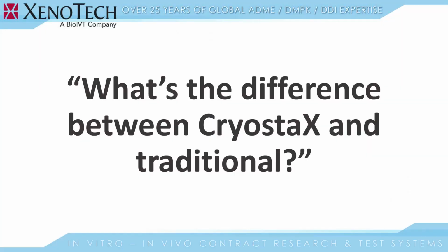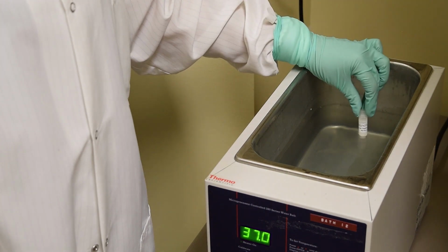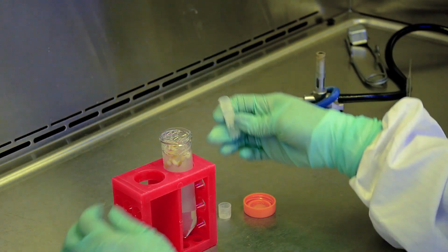The only difference between CryostaX vials and traditional vials is the method by which they are cryopreserved. CryostaX vials are cryopreserved in pellet form. This is very important because it eliminates the need for a water bath. A very common mistake when thawing hepatocytes is keeping your cells in the water bath for too long. This can greatly impact your yield and viability. So by eliminating this step, this improves your chances of having a successful thaw. CryostaX can also be completely customized to suit your needs. We can customize donors, yield, individuals, and pools quickly and easily without custom product pricing.